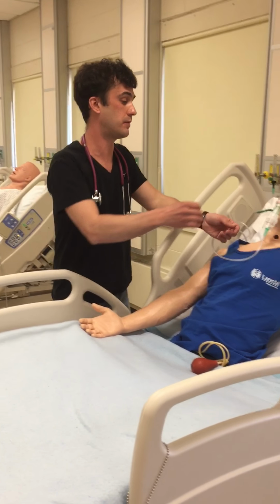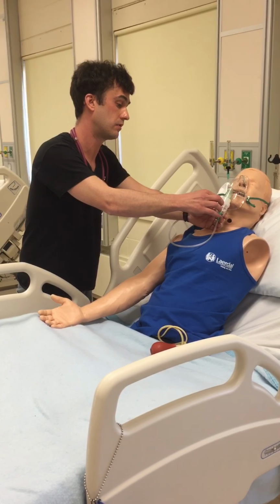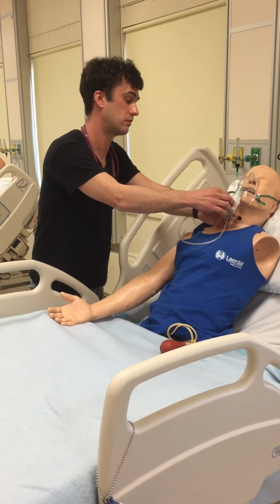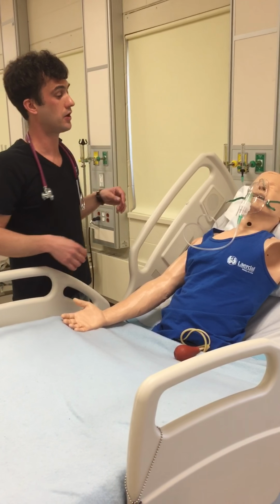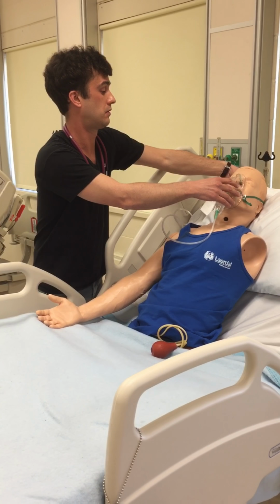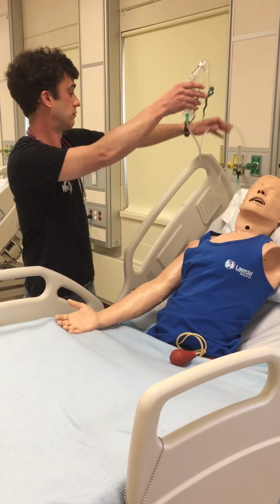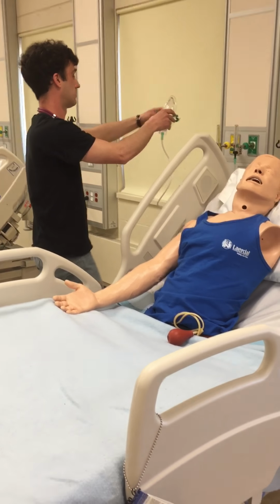Before stopping the treatment, I would shake or tap the nebulizer. Okay. The breathing treatment is now over. Take the mask off the patient before turning off the flow.